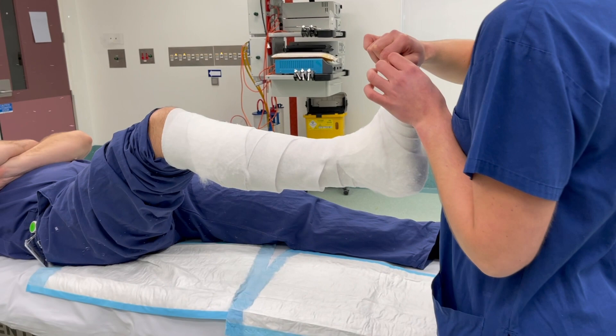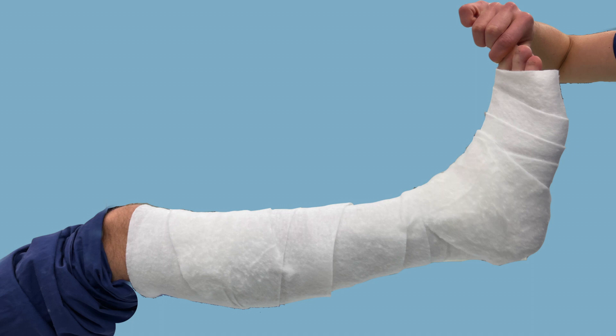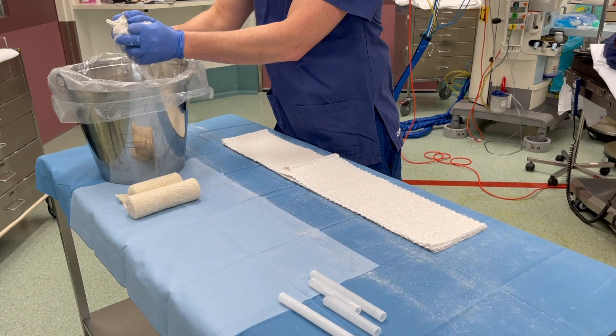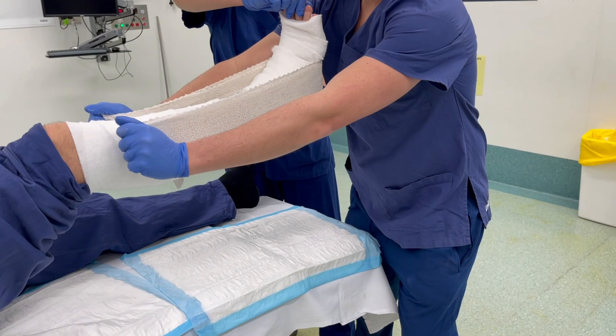For the application of plaster, the assistant holds the great toe whilst the patient's knee is flexed. It is important to ensure that the ankle is positioned plantigrade at 90 degrees. We apply the U-slab first along the medial and lateral side of the lower leg, then smoothing out the plaster to ensure there are no significant creases.